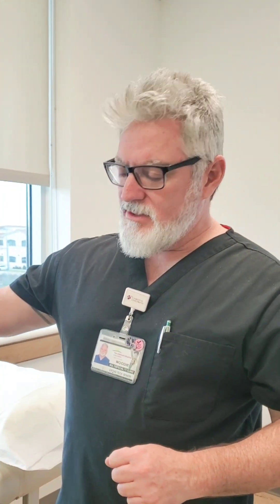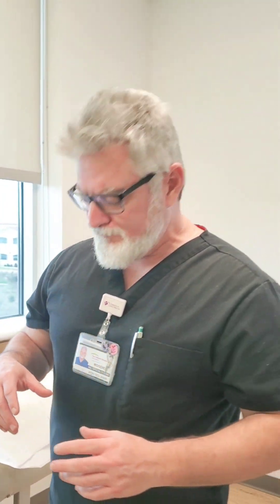Hey everybody, glad to have you back. A couple videos ago we did a Sarmiento brace video on how to apply a Sarmiento DME to a humeral fracture. It was brought up today while we were in clinic that in the collection of videos prior to the Sarmiento brace, we did not do a coaptation splint video, so we're going to do that today.